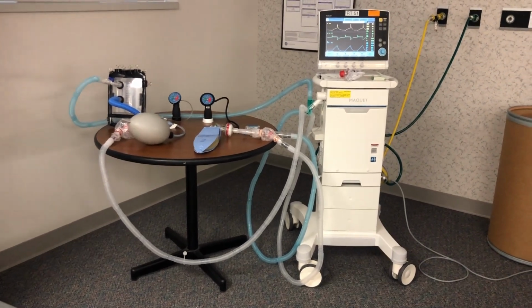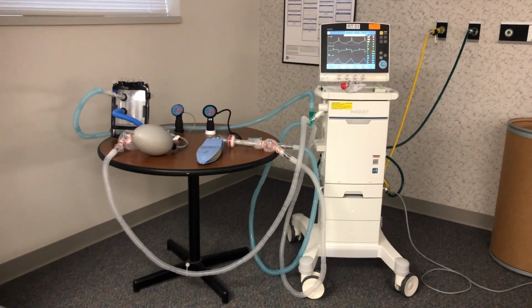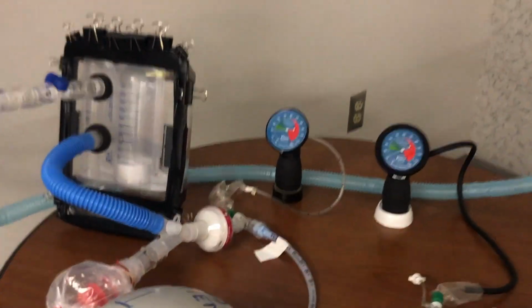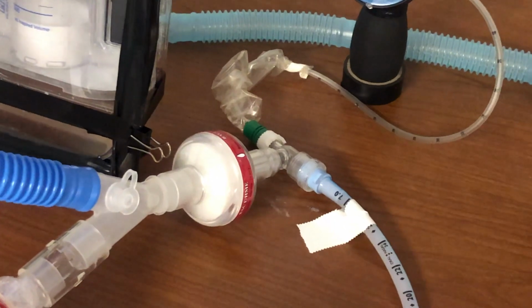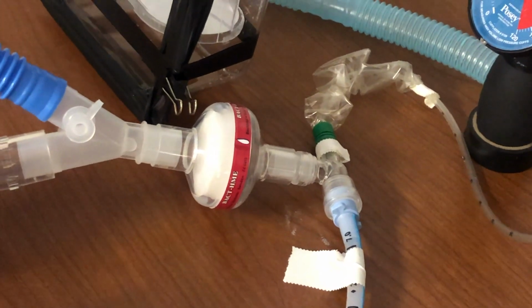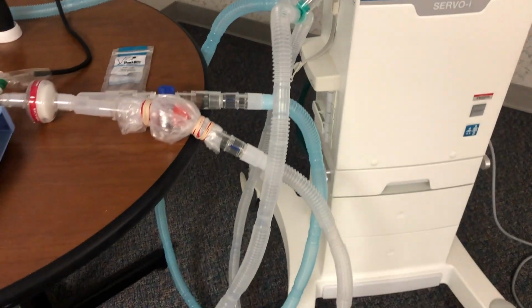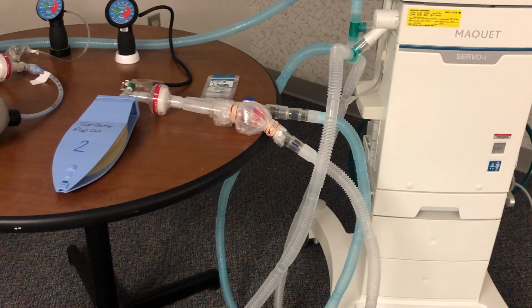There is some concern about cross contamination, so you should have these HME valves or other valves. Even if you don't want to use this HME valve, it actually serves a dual purpose: it avoids cross contamination and also humidifies air for the patient. So I have used these here, but you can use other valves, and the ventilator also has a HEPA filter, so there should be least cross contamination.